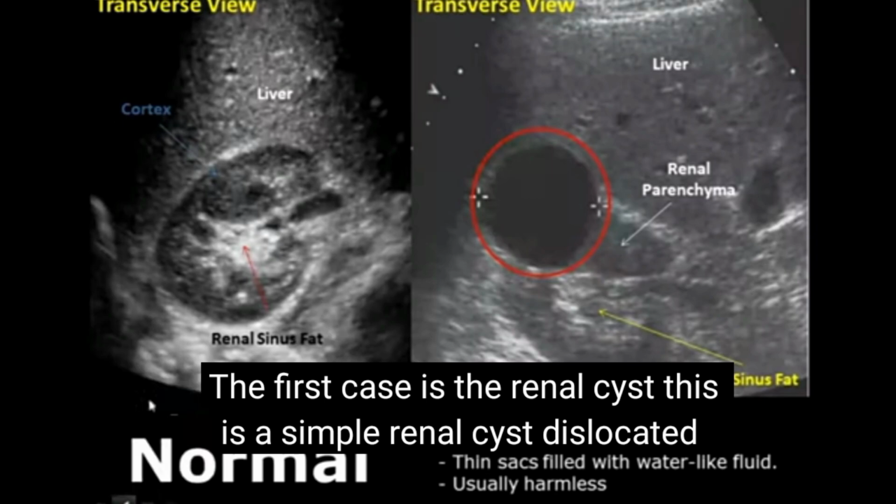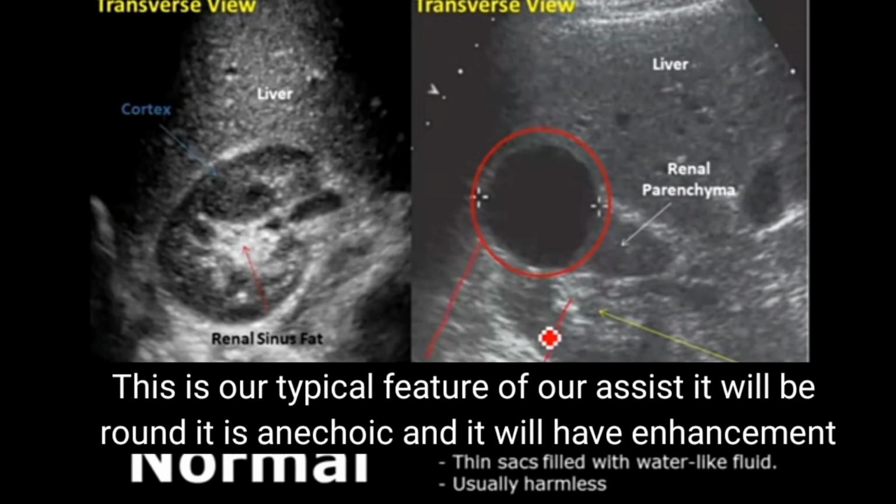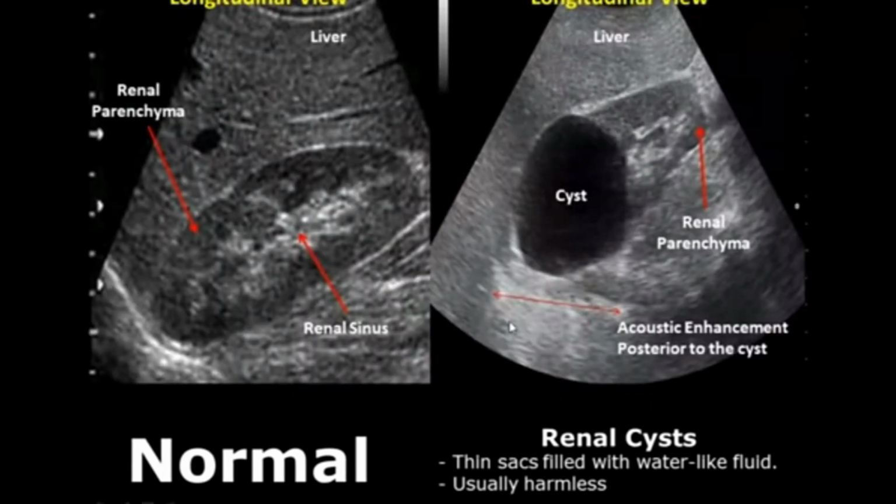The first case is the renal cyst. This is a simple renal cyst. In this region, we can see it's very round and it will have posterior acoustic enhancement. This is the typical feature of a cyst. It will be round, it is anechoic and it will have enhancement.